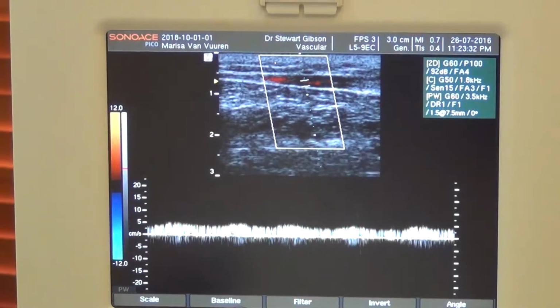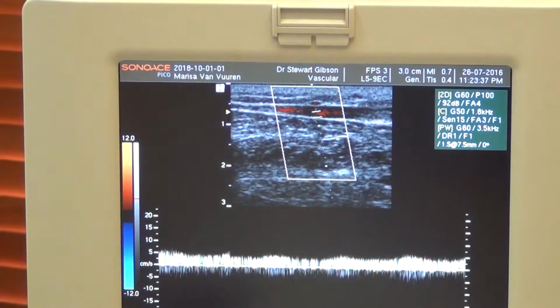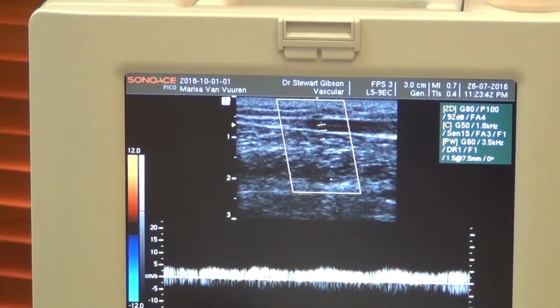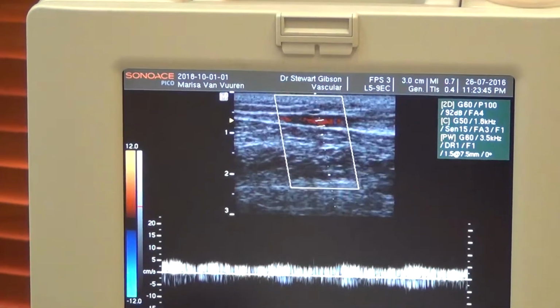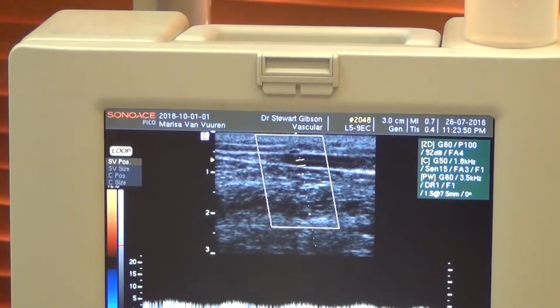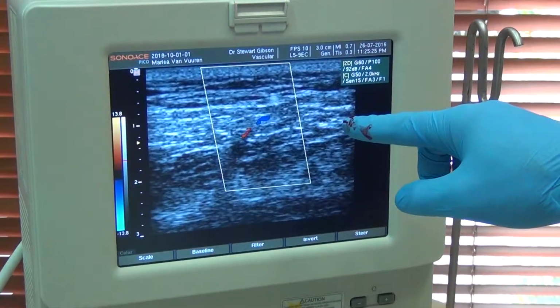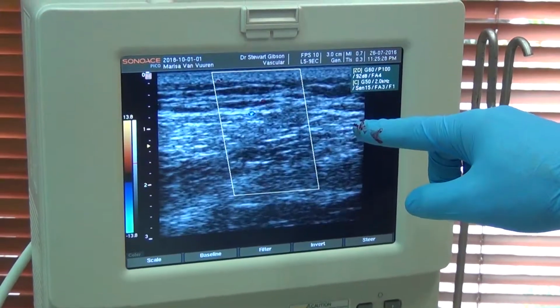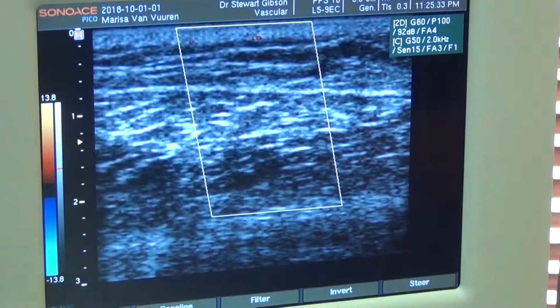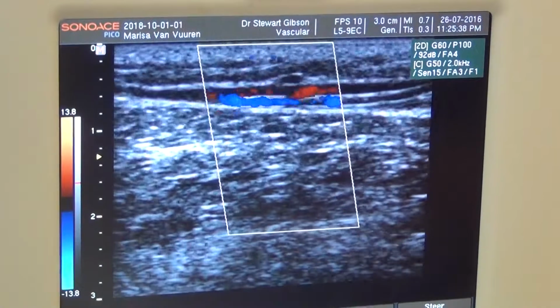We're going to introduce a sclerosant into this vein, and this should thrombose the great saphenous vein and prevent the reflux or the connection of the arteriovenous anomaly into the great saphenous vein. So we're demonstrating again that arteriole from the deep circulation that's going to the surface, to the vicinity of the great saphenous vein. And if you look at our saphenous vein, you'll see that it definitely has a pulsatile component.